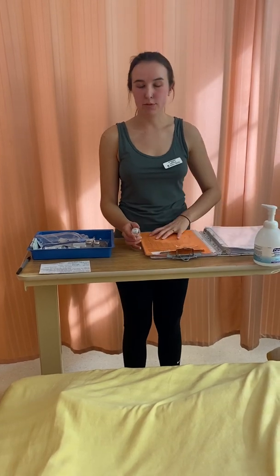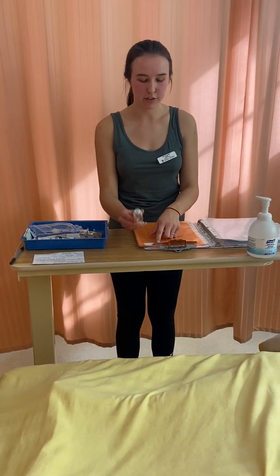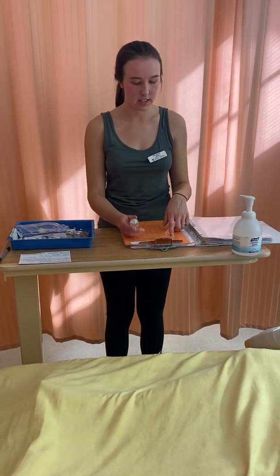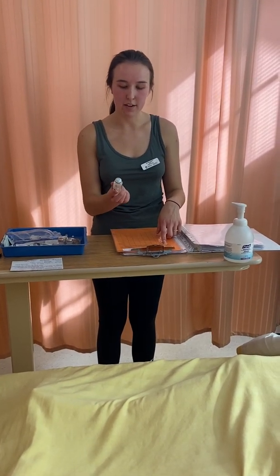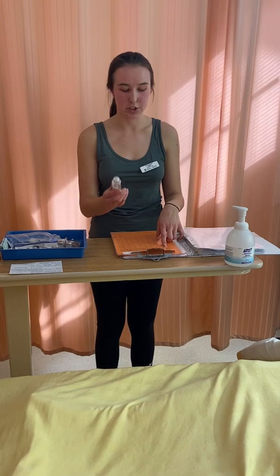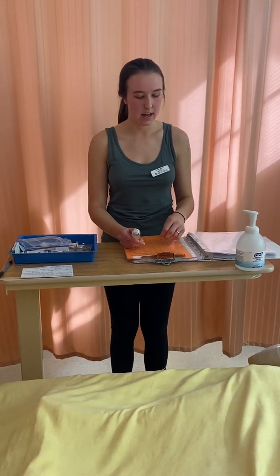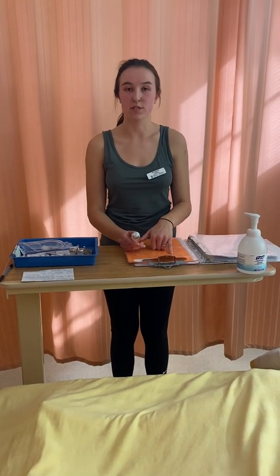So I'm going to do my first check now. My right patient is Fiona Friedman. My right medication is vancomycin. My right dose is 500mg. I have a 1g vial of vancomycin, so once reconstituted, I'm going to be able to pull out 500mg. My right route is IV — this is IV vancomycin. My right time, rate, and frequency is every 12 hours, so the dose is due now.